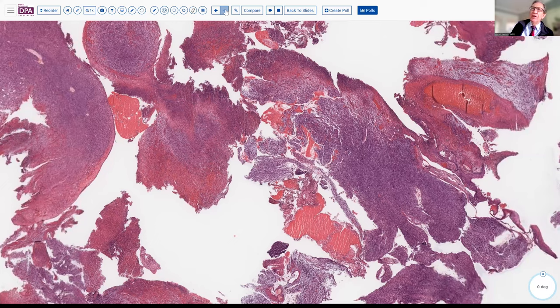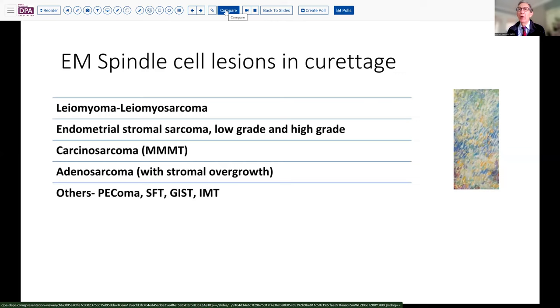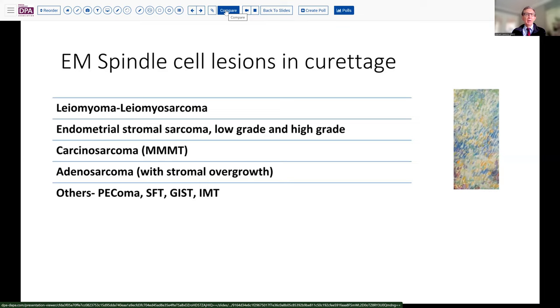Stepping back, we want to think about what are the spindle cell lesions that we can see in a curettage specimen in this setting. Of course, smooth muscle tumors are perhaps the most frequently encountered ones. This does not have the appearance of leiomyoma, but leiomyosarcoma might be in the differential consideration.